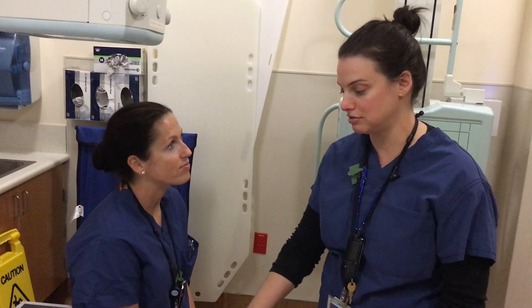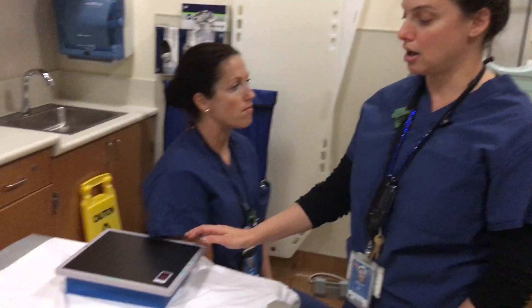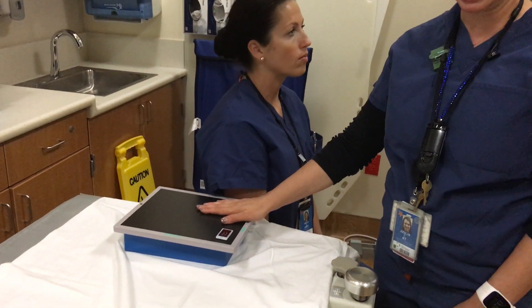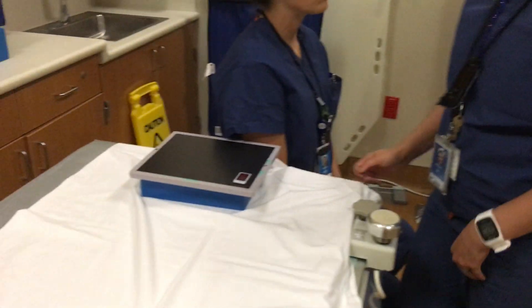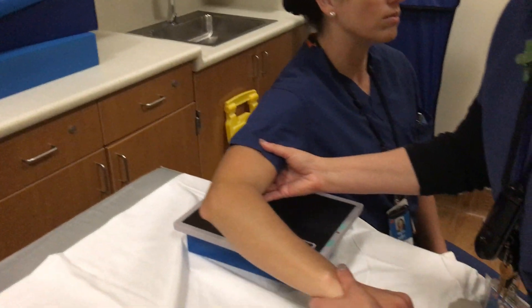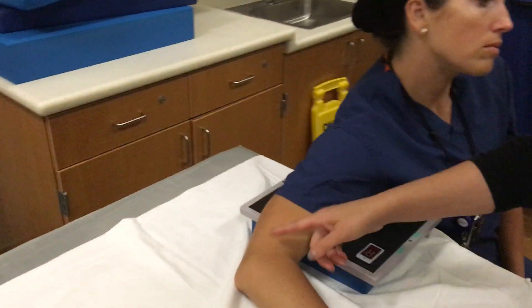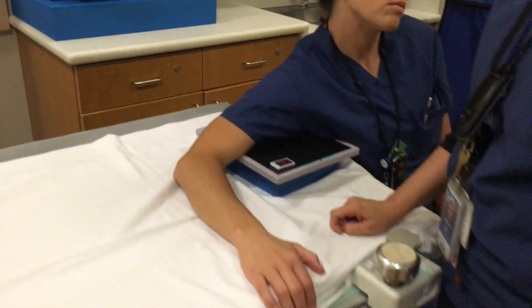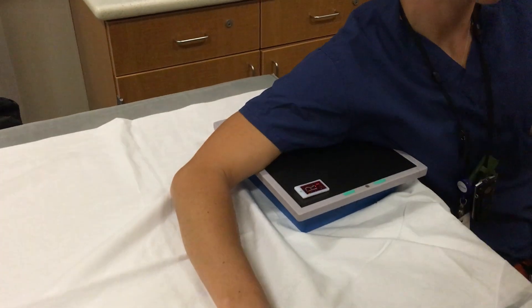Today we're going to do an axillary view of the shoulder. You're going to have your patient sitting down. You're going to put a non-gridded 8 by 10 lengthwise to the patient. You're going to ask them to bring their arm up and then place it across the cassette. You're going to have their elbow at a 90 degree angle and their hand prone.